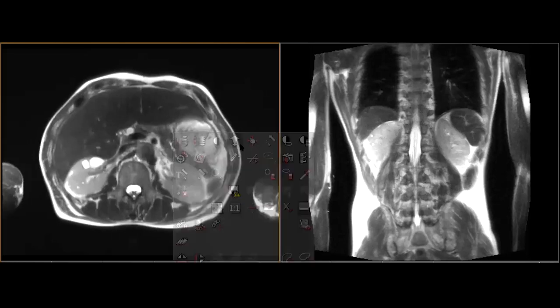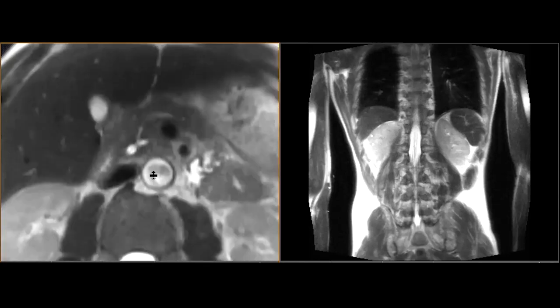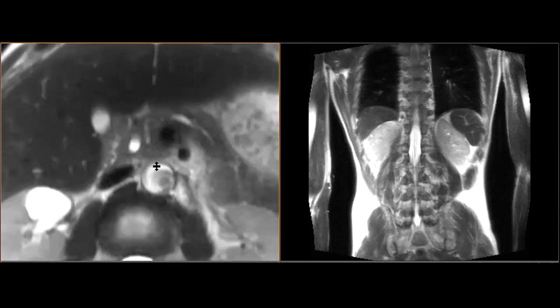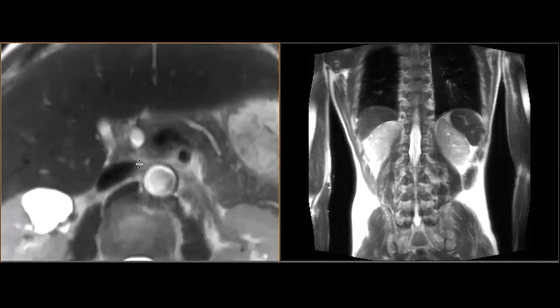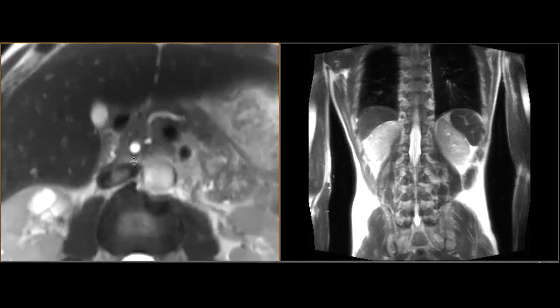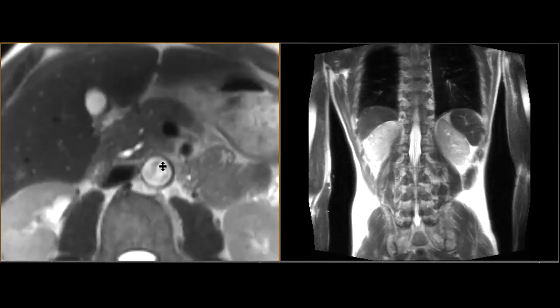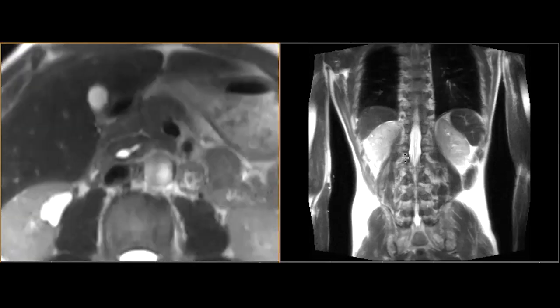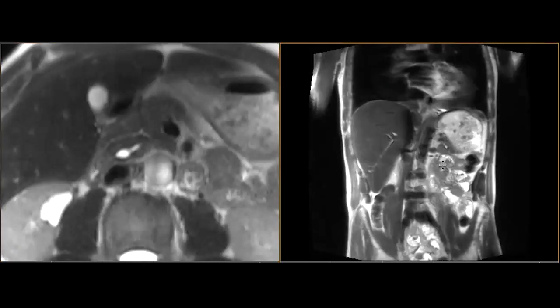Looking at the biliary tree, there's no apparent etiology for these findings. There are no filling defects to suggest choledocholithiasis, and I'm not seeing layering sludge. There is biliary ductal dilatation, but the etiology is uncertain. Let's look at the coronal images to see if that helps.